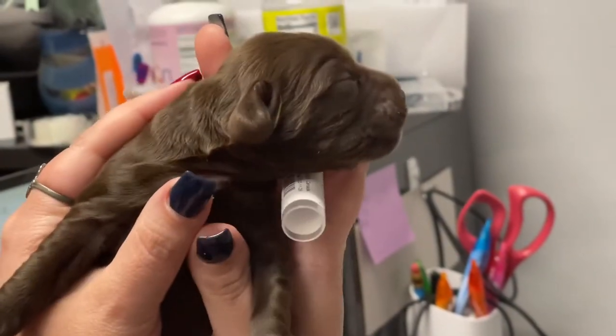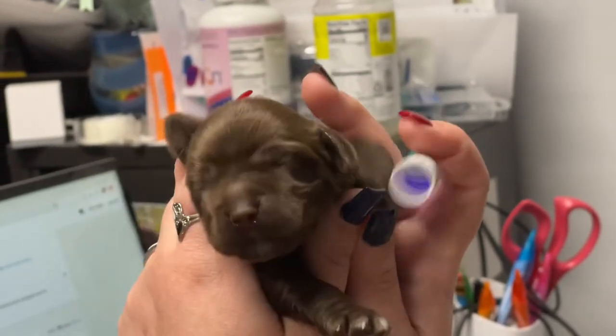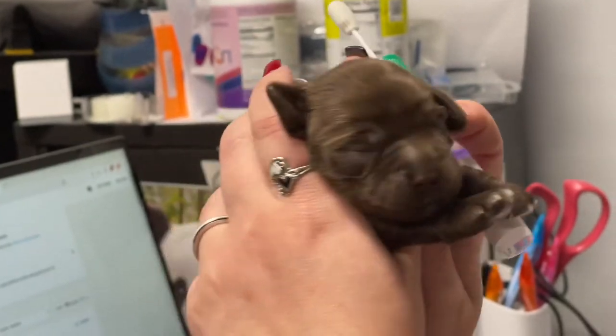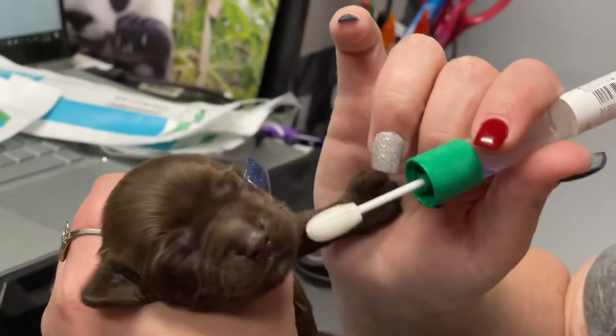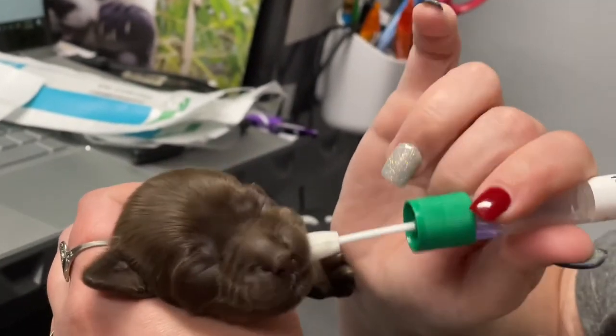We have a little chocolate girl. She was born on June 29th, so she'll be a week old at 2:30 in the morning. We have cheek swabs and we're going to swab her. This is how you swab itty-bitty puppies — first, you separate them for over an hour from one another and from mommy.